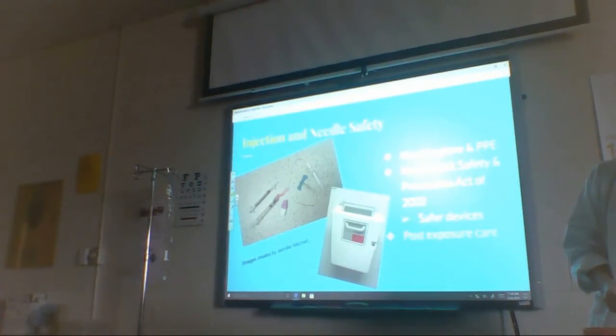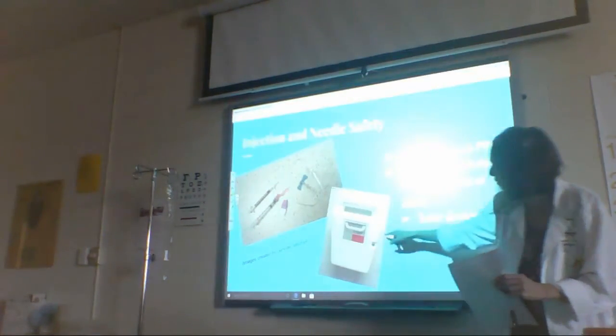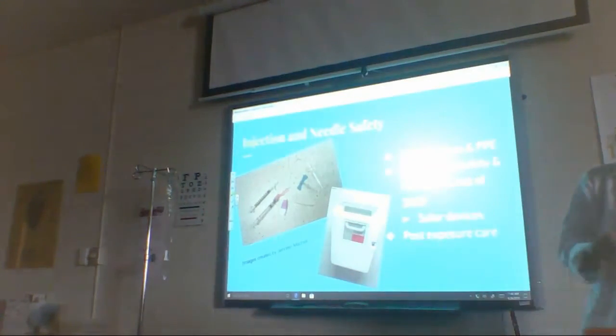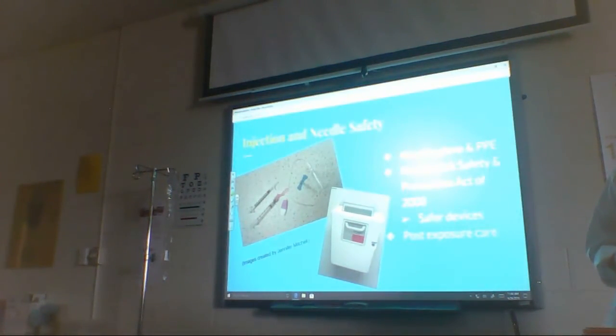Implement engineering controls for sharps disposal containers. So this is an engineering control. We've got the sharps box, but the sharps box is in another box, right? The self-sheathing needles, safer medical devices like sharps with engineered injury protections and needleless systems. You've got your blunt needles. Those are like your needleless systems. Or you've got those blue connectors on your IVs. And employers also have to train their employees on the proper usage of engineering and workplace controls to keep them safe.